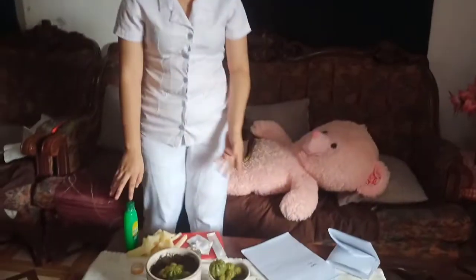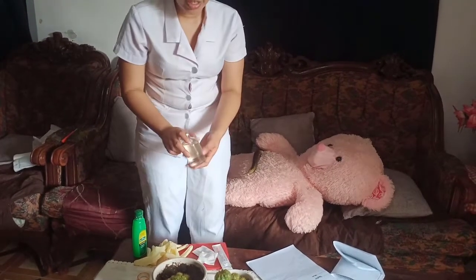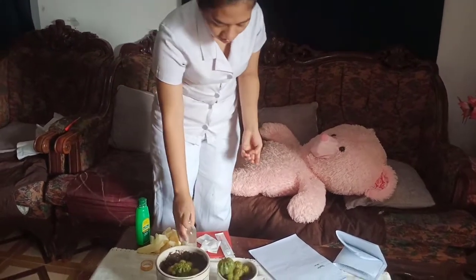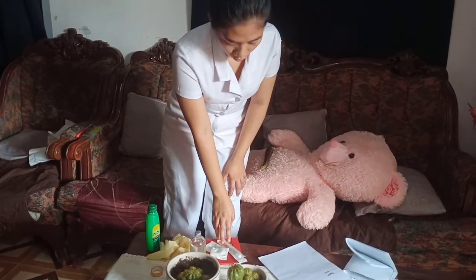So we have the alcohol, gloves, insulin vial, then cotton balls and syringe. Then now we're going to perform hand hygiene and observe the appropriate infection prevention procedure, to deter the spread of microorganisms. So I'm done hand washing.